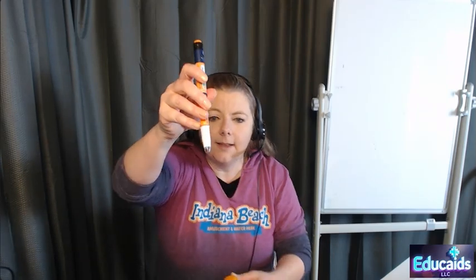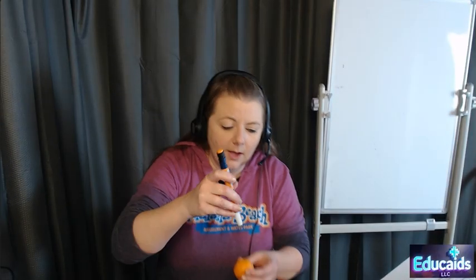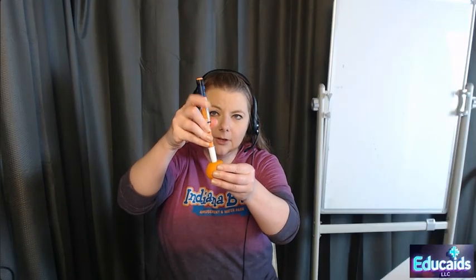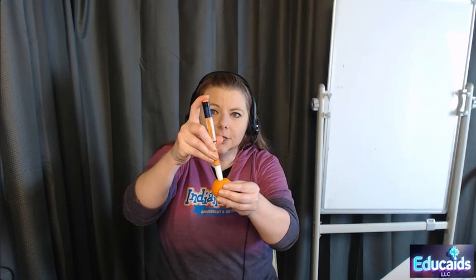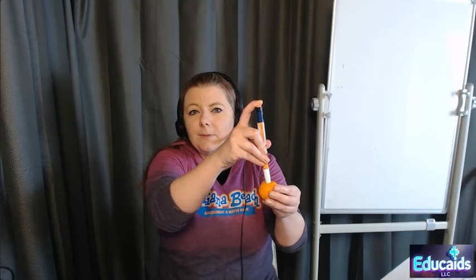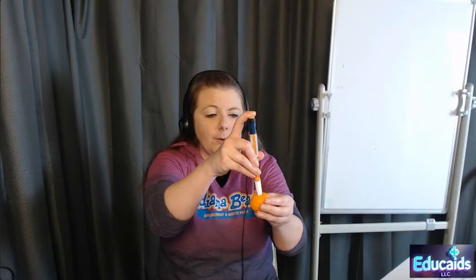These are very fine needles. And I want you to see that this has a safety needle on it, or a safety cover. Once you give it, you're going to have the needle go into your patient, and then you're going to push down on your button, and then you're going to count 6 bananas. 1 banana, 2 banana, 3 banana, 4 banana, 5 banana, 6 banana. We'll go over that in a little bit, why we do that.